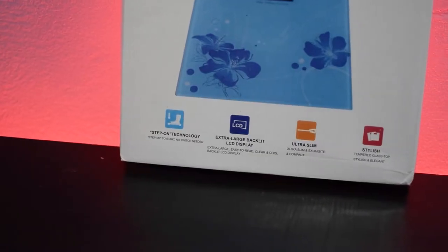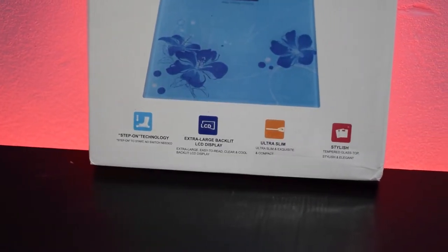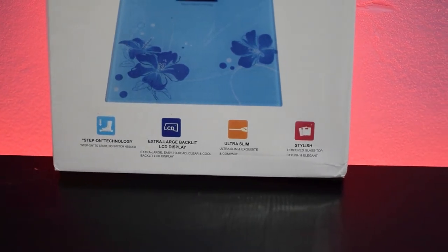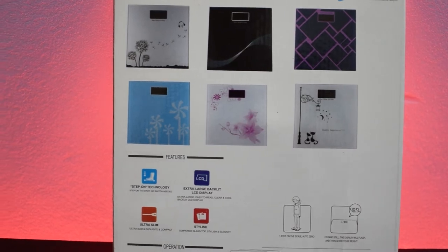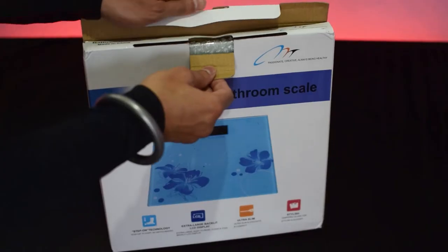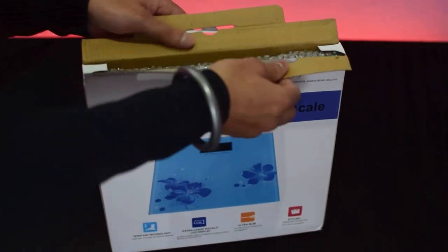On the front side of the box, all the highlighted features are printed, and on the back side we see all the themes of the Wing Scale from Niscomet. Let's take out the Wing Scale from the box.